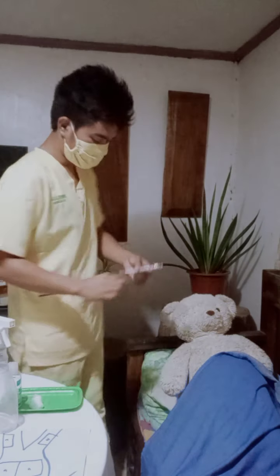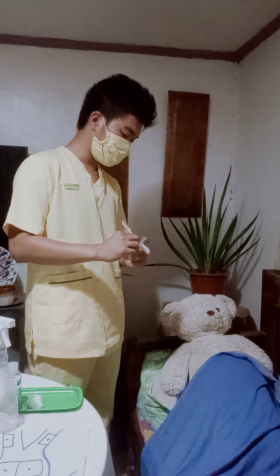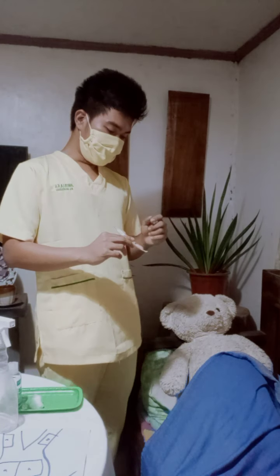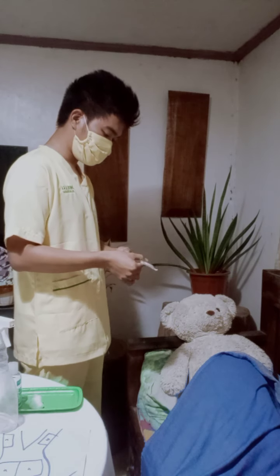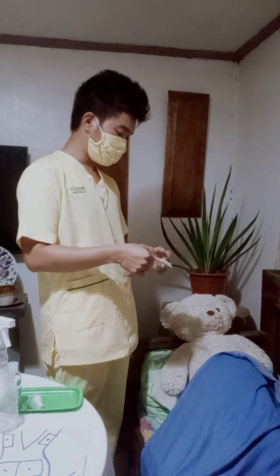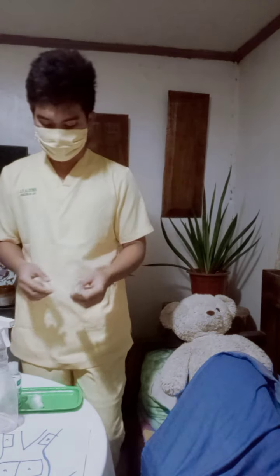So ma'am, ito po yung syringe. Ito dapat yung area na huwag natin hawakan dahil para hindi makontaminate. Ito yung plunger, ito yung needle. So yung needle, bago po natin hawakan. So ganun. Assuming we are already done explaining the parts of the syringe to our patient.